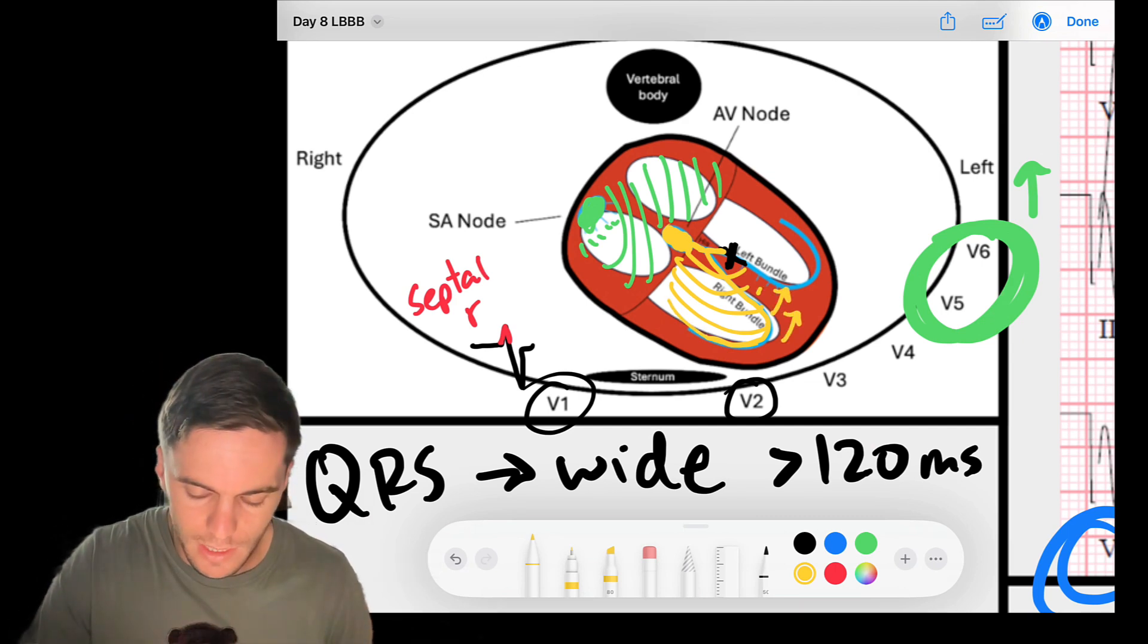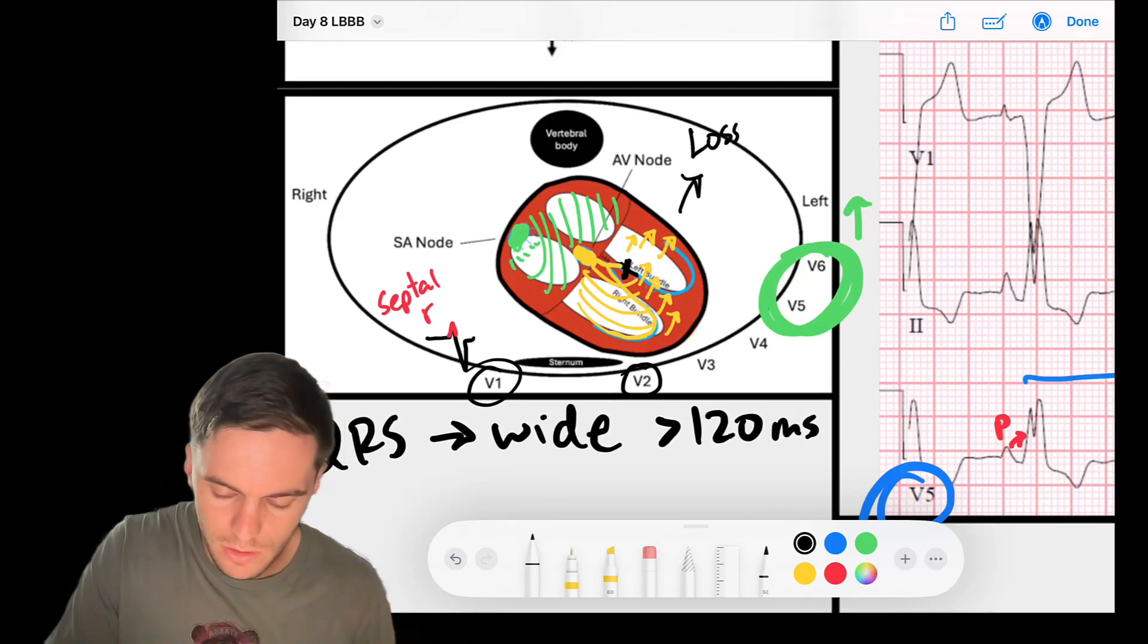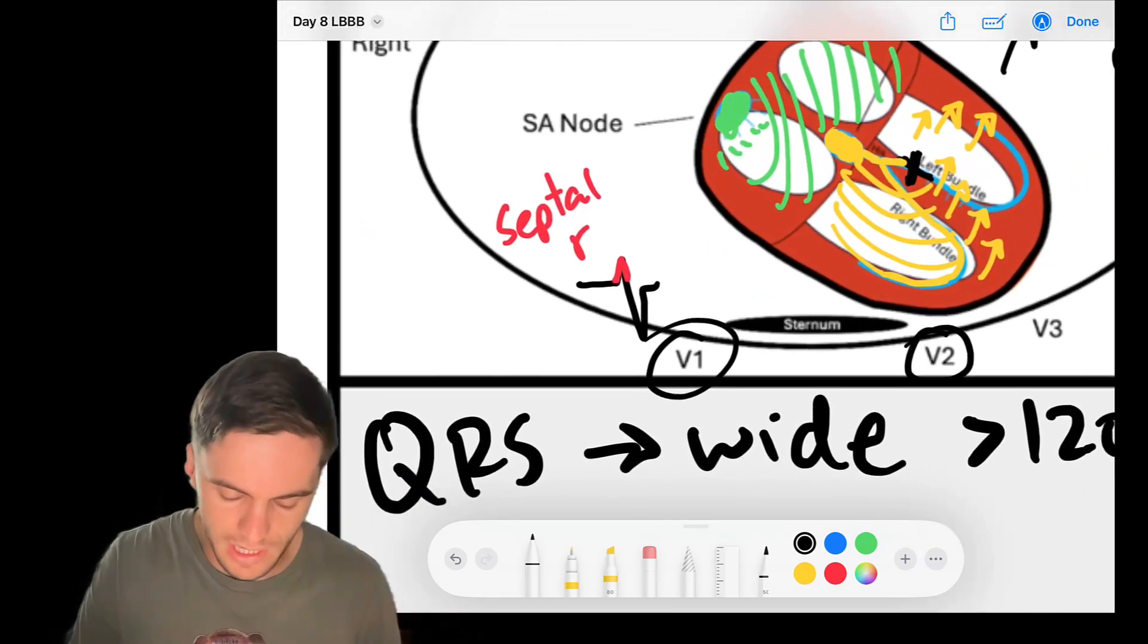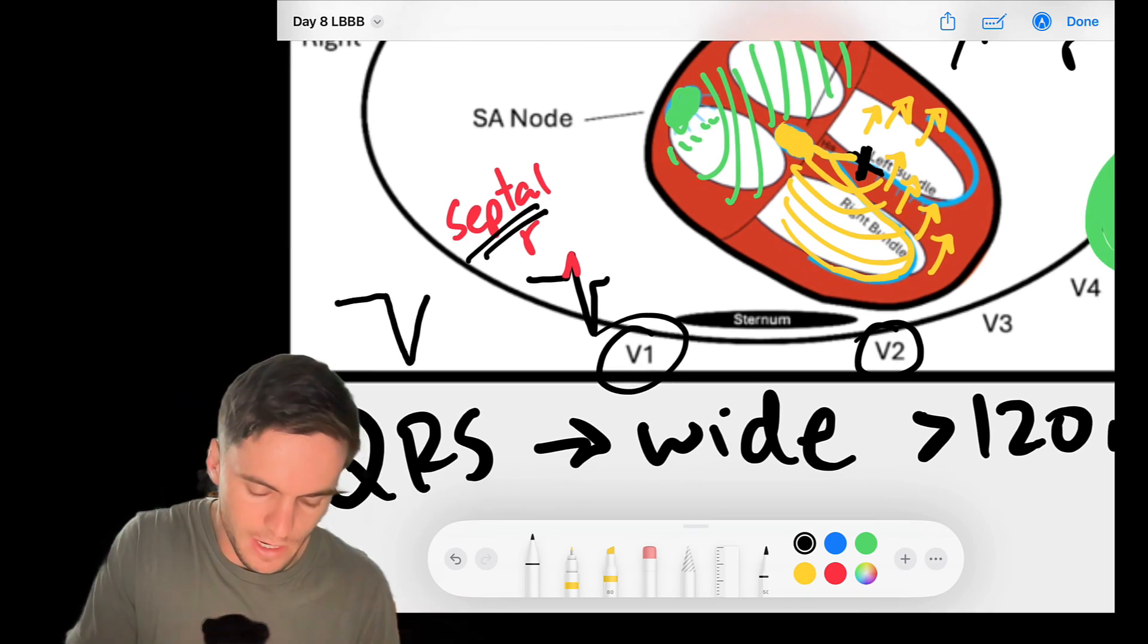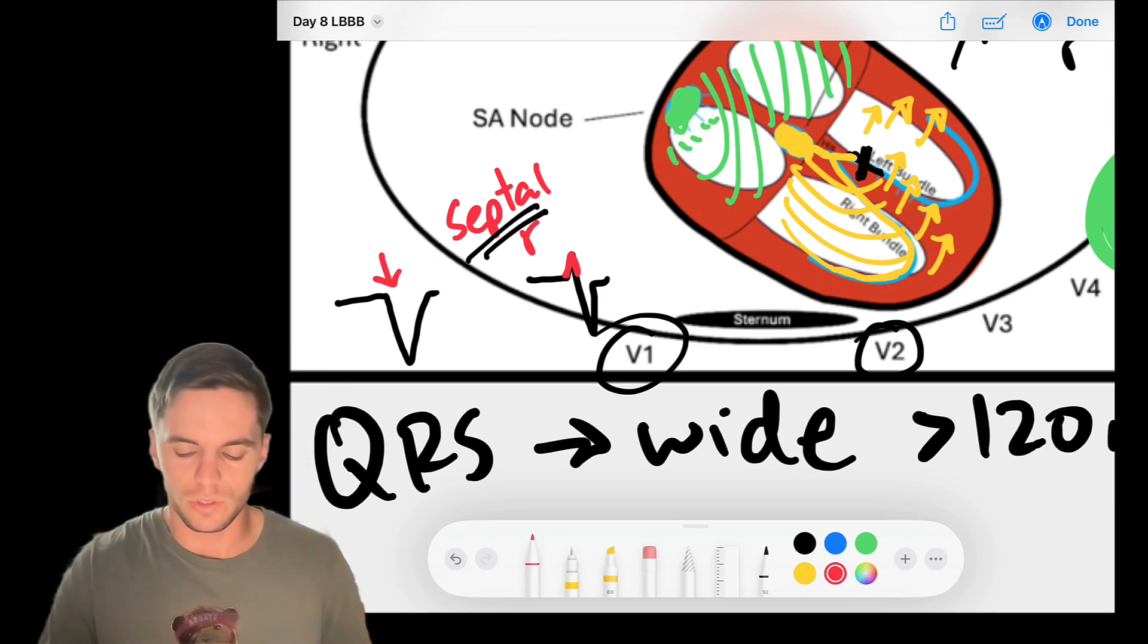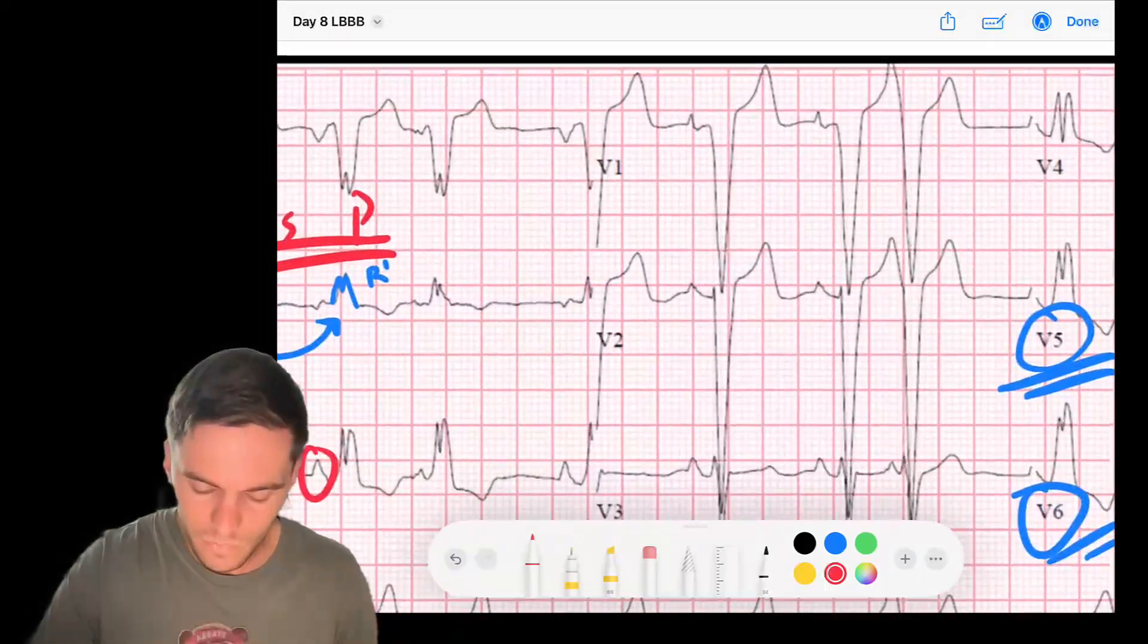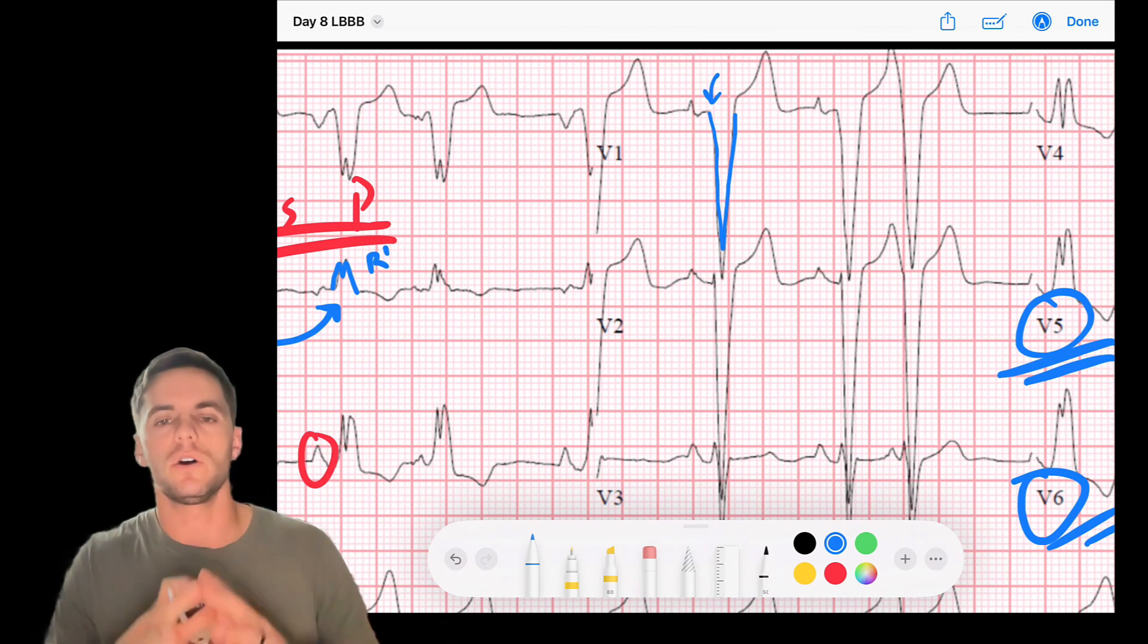So in a left bundle branch block, what I'm getting at is we also get the loss of the septal R wave. So we will no longer see that septal R wave. What we'll actually see is just a straight negative QRS complex where that septal R wave is no longer there. So look at V1 in this EKG. My QRS complex has no septal R wave. There is no septal R wave here. And that is how you can also determine the fact that this is a left bundle branch block. It's more evidence.